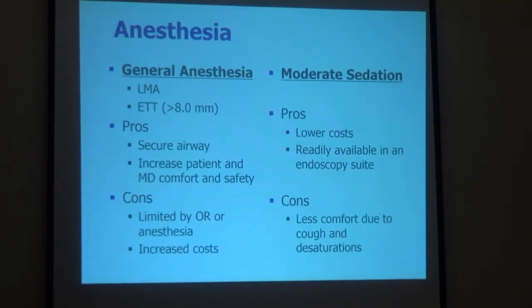تاني حاجه ان انت عشان تعمل جنرال انستيزيا، مش في الاو ار الاندوسكوبي سويت، تنفع تتقلب جنرال، فبتضطر تاخد العيان اوضه العمليات. العيان اللي بيشتغلوا باللوكال بيشتغلوا في وحده المناظير بتاعتك، فدي بتبقى ميزه كويسه. لكن طبعا بتبقى مشكله العيان، انا دايما بقول المنظار عباره عن كحه، كل المنظار هيبقى فيه كحه كتير، فدي بتبقى مقلقه ليك، وساعات بتعصب الشخص اللي بيعمل المنظار من العيان اللي معاك عمال يكح يكح يكح، فدي بتبقى مشكله. فهي دي عيوب القصه دي.